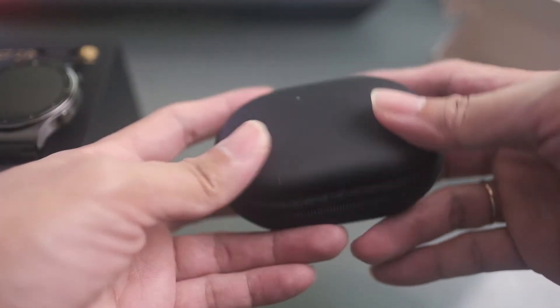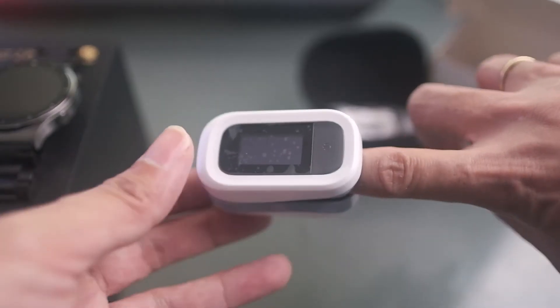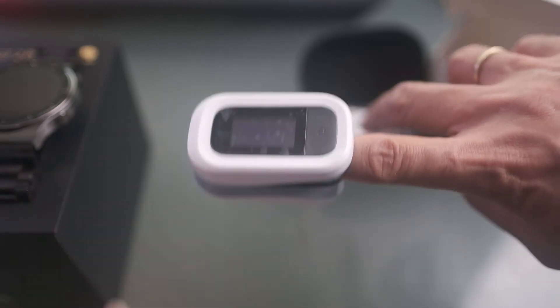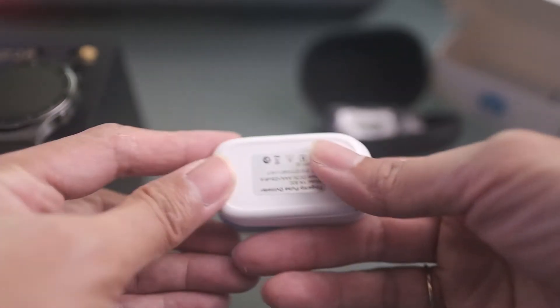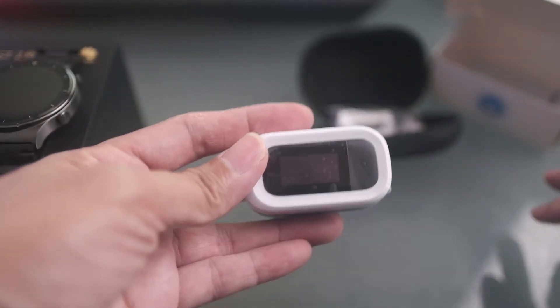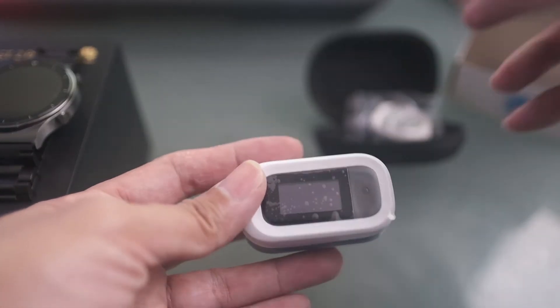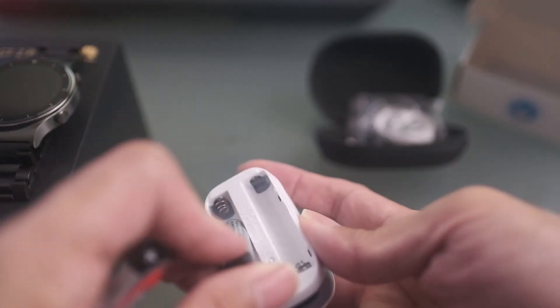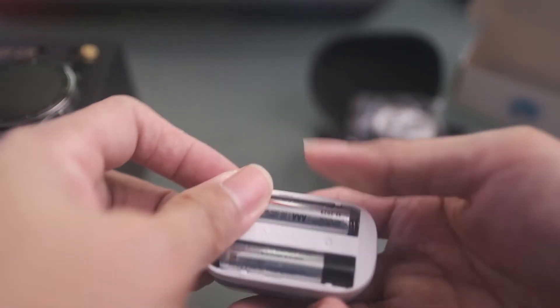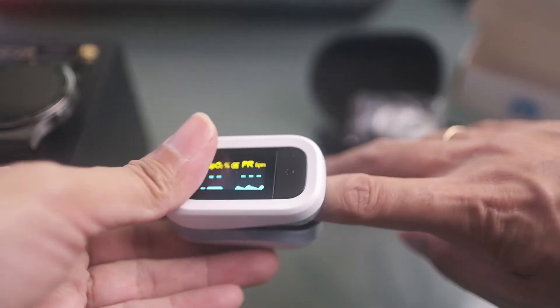Let me unbox this fingertip pulse oximeter and see what's inside. It came with a nice pouch. You can measure SpO2 or blood oxygen through this device. It runs on a AAA battery, which is not included in the box. There's also a strap. Let me find a AAA battery and place it in.